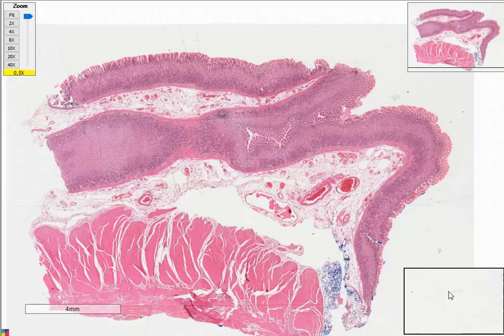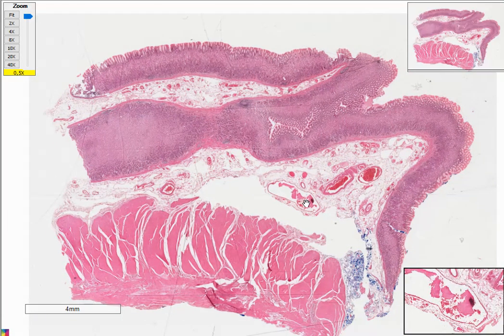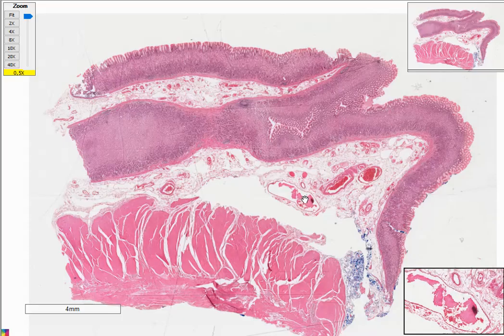Today we'll look at the stomach histology using a digitized slide that we have here, and we'll cover the mucosa, cell types, muscle layers, and physiology of their secretions, and how the stomach histology changes from fundus to pylorus. And we'll look at the other slide that we had done the other day concerning the gastroesophageal junction, so that we can understand how the histology of the stomach changes from the fundus all the way to the pylorus.